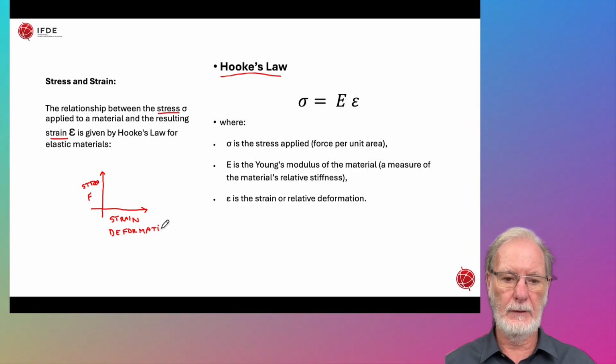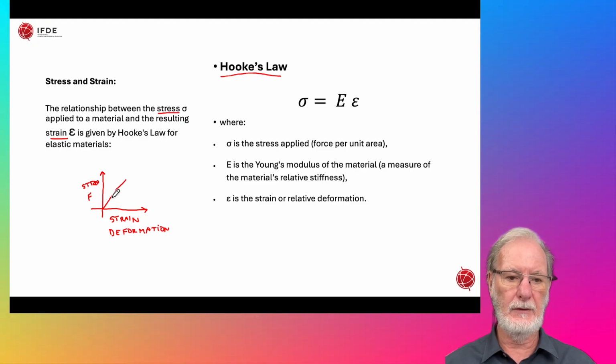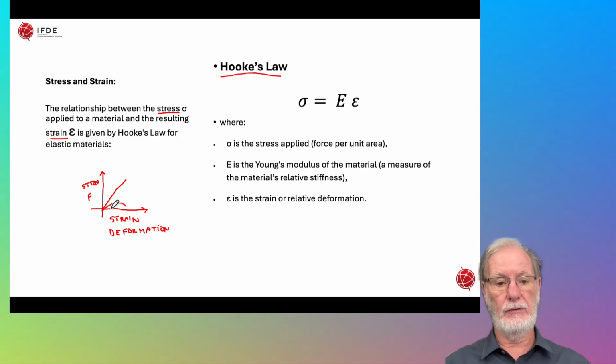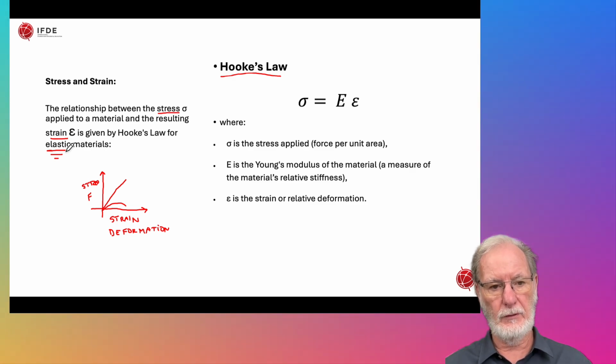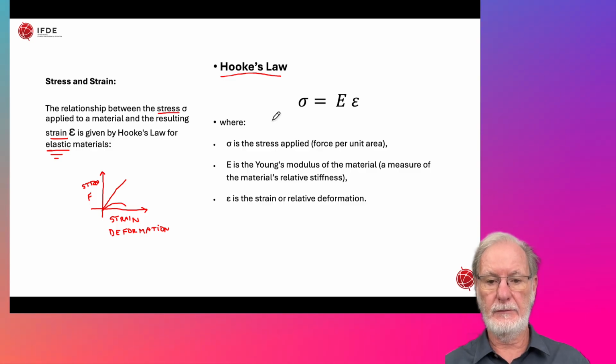every single material we use has a specific stress-strain curve. It could be completely linear, it could be this way. So many materials can be obeying Hooke's law because all the materials are not necessarily fully rigid, so they have elastic properties that are taken into advantage. The best example would be nitinol wires for fixed orthodontics, and obviously aligner materials for aligner orthodontics. So we're going to apply the stress, which will translate into a force per unit area, which becomes a pressure.